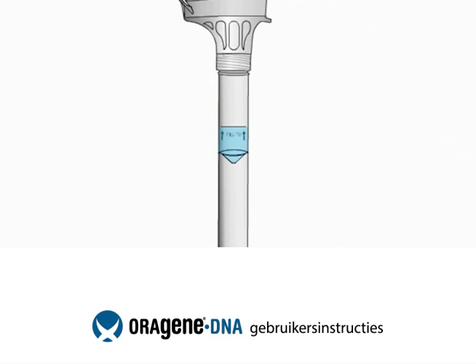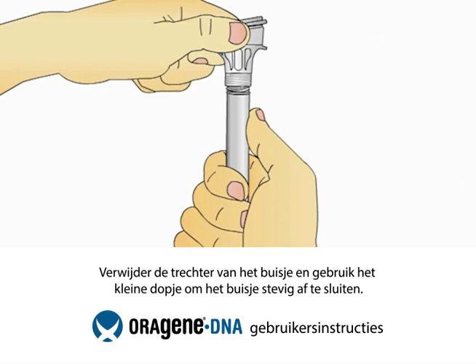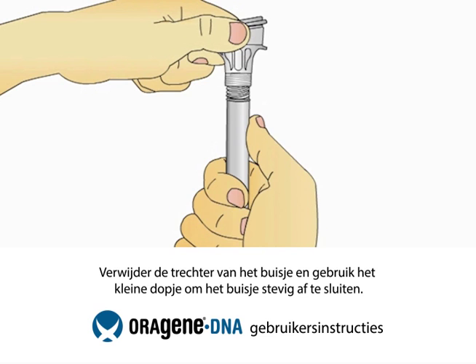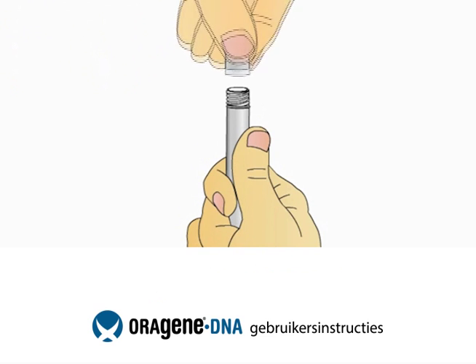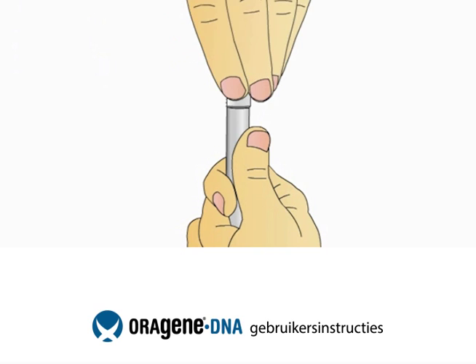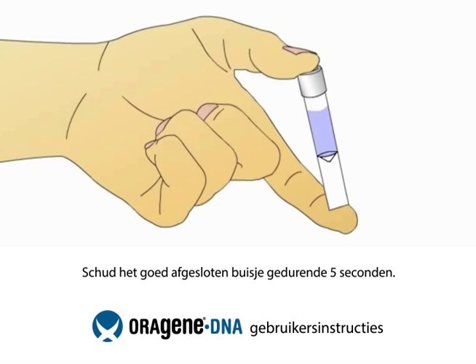You will notice that the solution from the cap will mix with the saliva in the tube. This solution stabilizes and protects your sample until it is analyzed at the lab. Hold the tube upright and unscrew it from the funnel. While keeping the tube completely upright, pick up the small cap and use it to close the tube containing your sample. Shake the capped tube for 5 seconds.